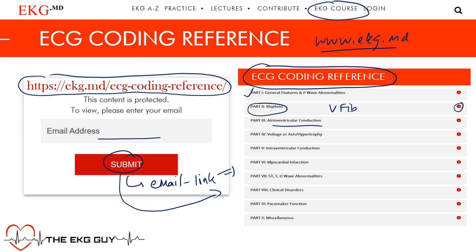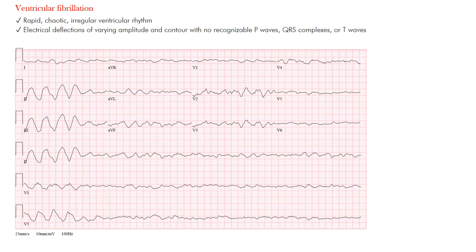So ventricular fibrillation — what is this? This is chaotic ventricular depolarization occurring without any synchronized ventricular contractions. As a result, there's no cardiac output, and this could result in sudden cardiac death without any advanced life support.